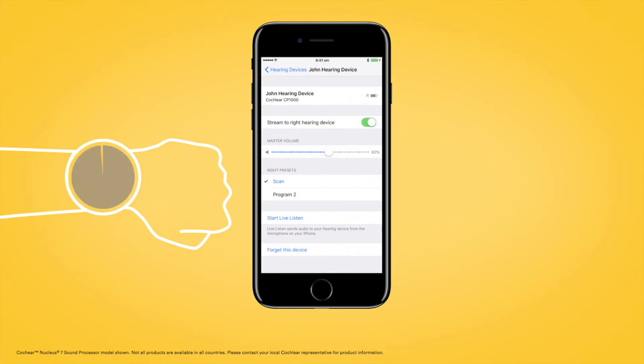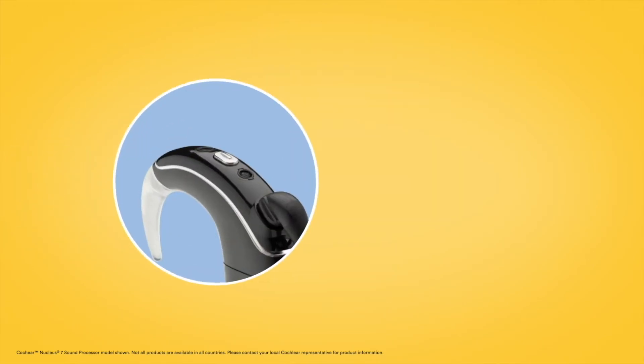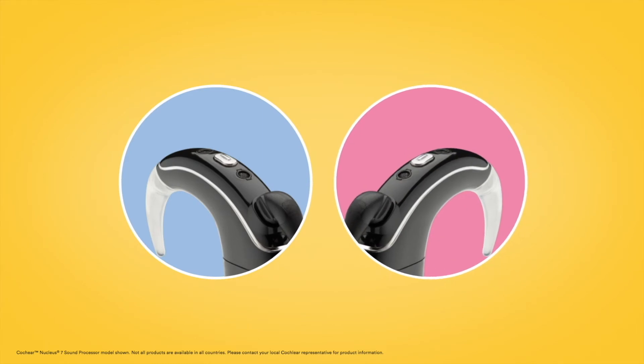The pairing process may take up to 120 seconds. If you have two sound processors, both need to be paired during the same pairing window.